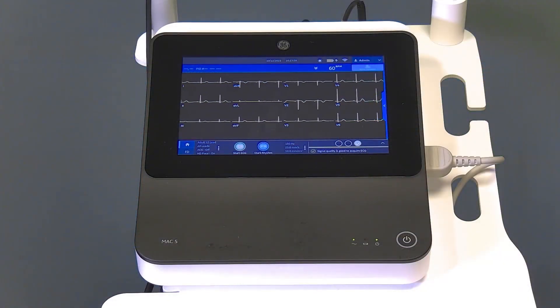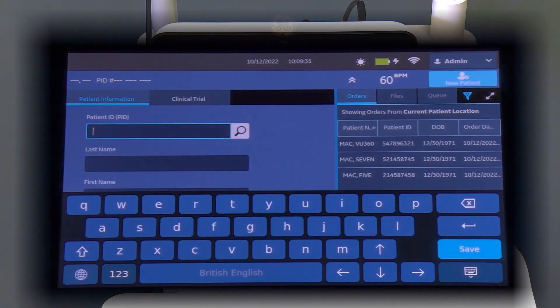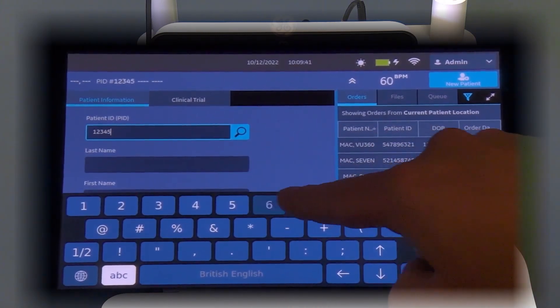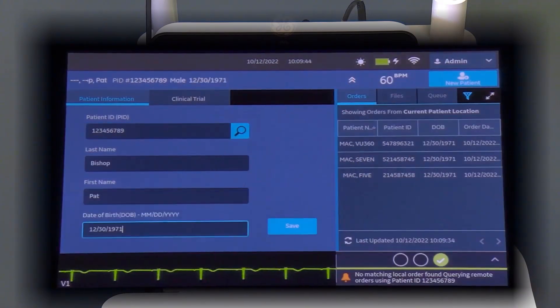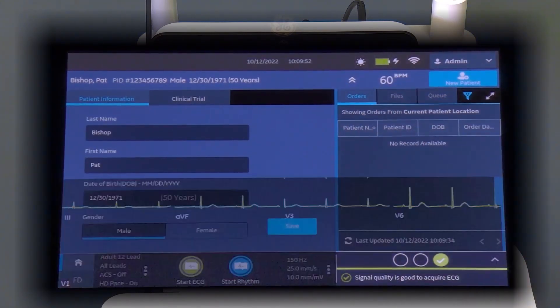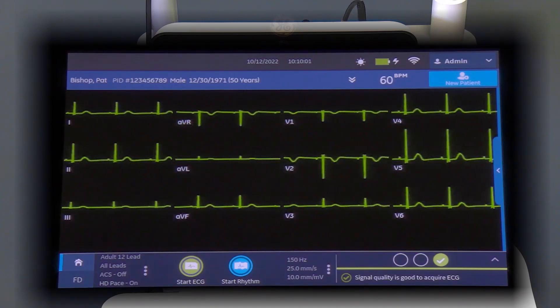You can also carry patient ADT information by typing in the patient ID and searching. If no order or ADT interface is established or this information is not available, the user can manually enter the patient demographics by tapping the appropriate demographic field and typing in the information with the touch screen keyboard. Be sure to always include the patient's gender and age, as these two values are critical to the interpretive statements in the 12SL analysis program. Once the patient data fields are complete, press the save tab.